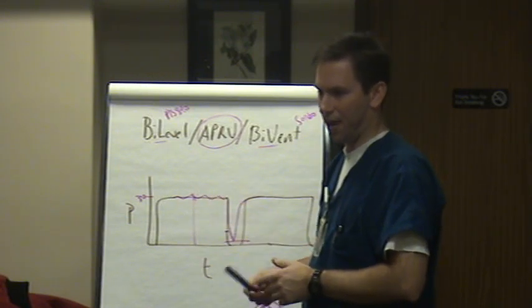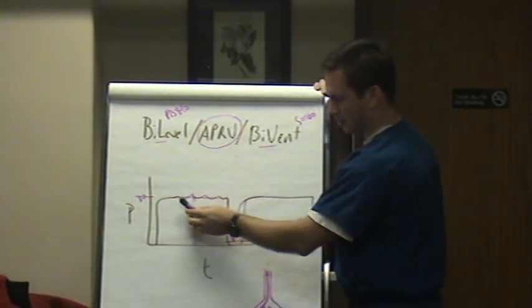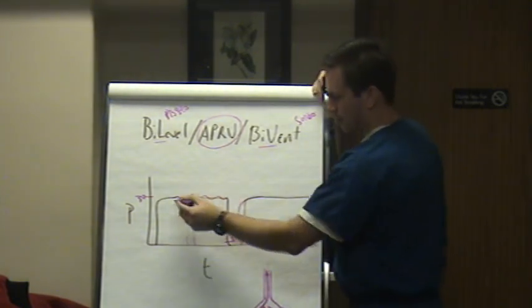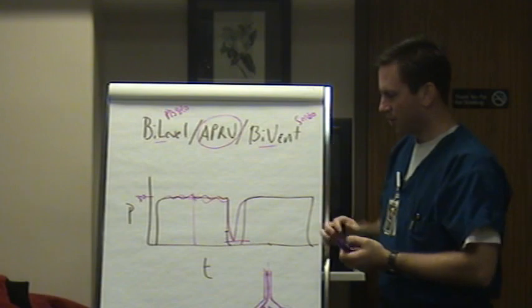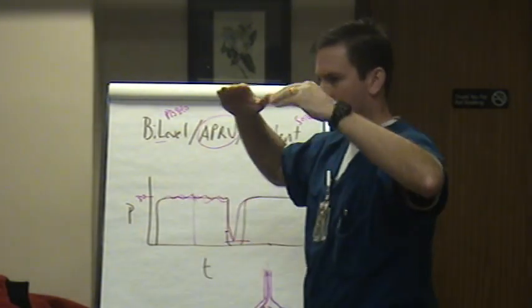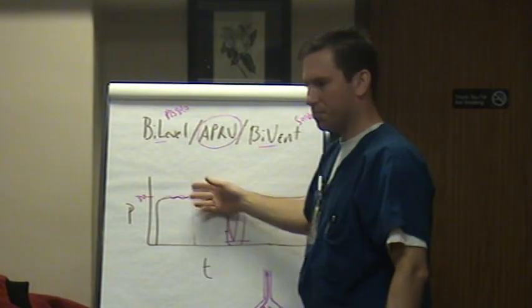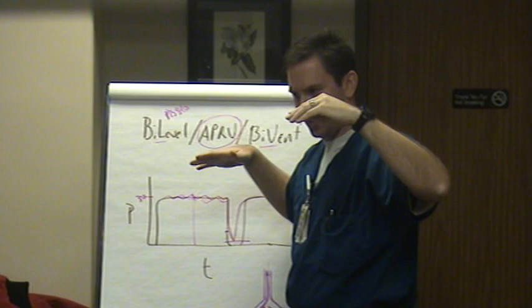This should be taking mode of high frequency. If you think about it, Dr. Simpkins, I want you to take note of this. If you look at this pattern that I'm drawing, I see it's like a high frequency. It's just like an oscillator. That's what oscillator does. The oscillator goes to a mean, holds it at 30, and it pants for the patient around it. Well, this mode allows you to go to 30, let the patient pant for you, and fix their CO2.